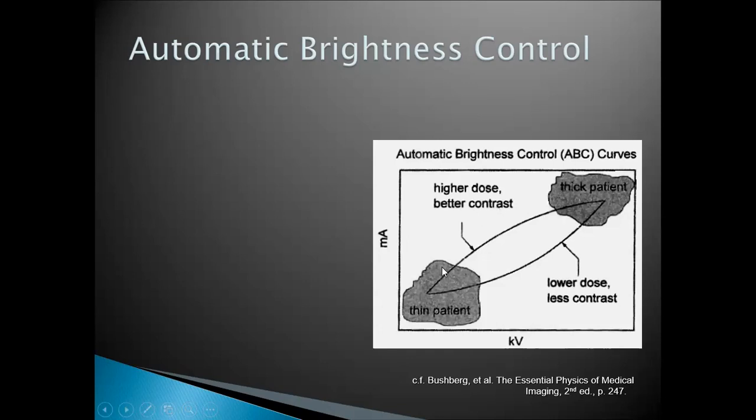So a little increase in the mA is going to affect contrast better than the kV. The kV wouldn't have so much effect in increasing the contrast here. Much of the contrast has to do with the mA, which determines how good the contrast is going to be. But the kV is basically meant for lesser dose.